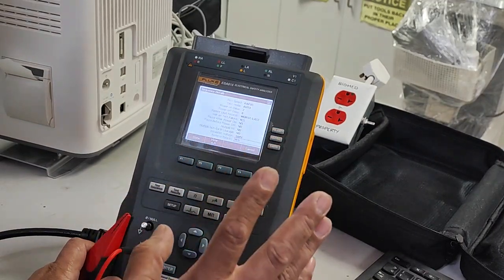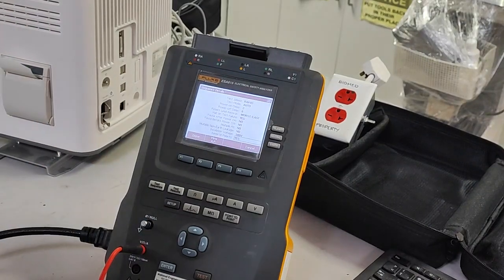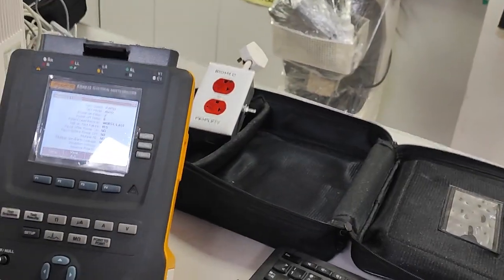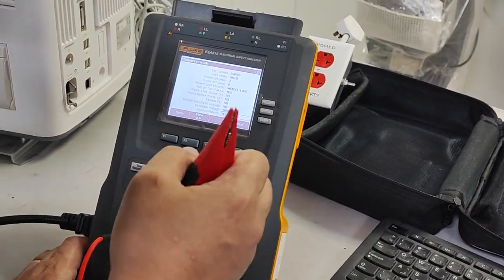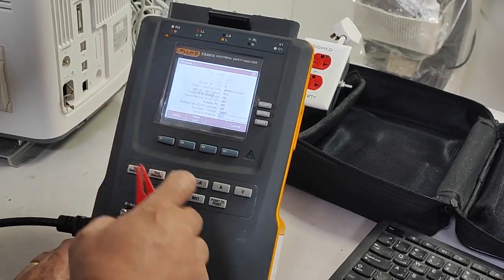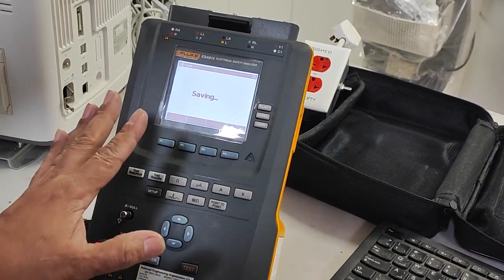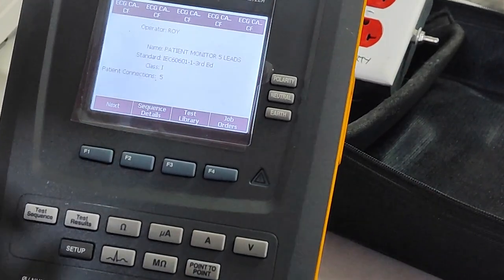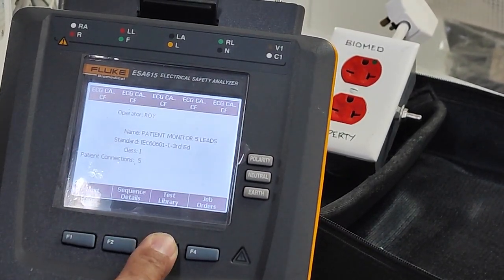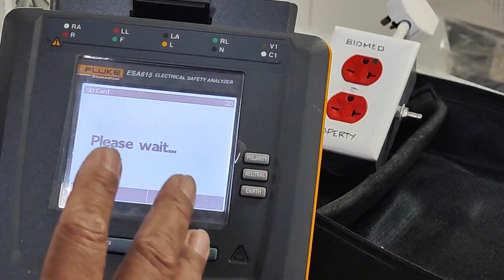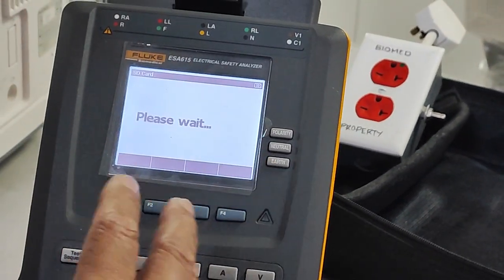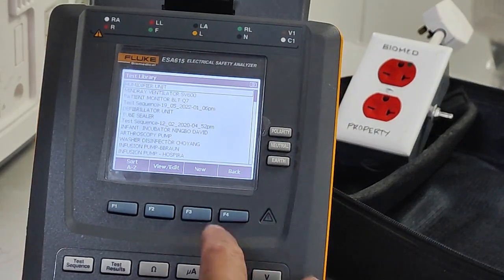We are checking the reverse polarity of this patient monitor. This is a sample test for the patient monitor. Before testing, enter the details. Once you finish the selection of the sequence details, click Done — it will save your test sequence. Now we are on the patient monitor test. If you are checking equipment, go to the Test Library. Press the Test Library and it will go to the equipment library.